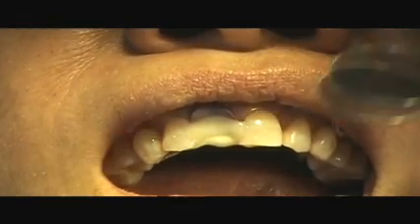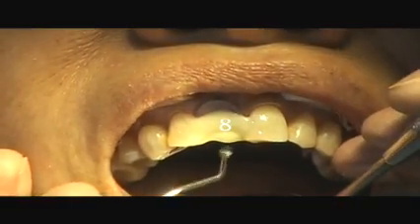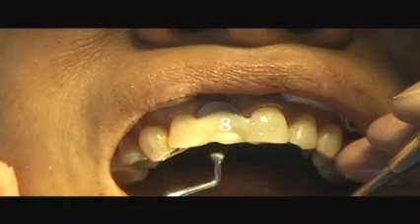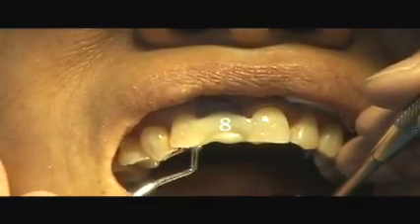A fourth layer is placed on the lingual to ensure proper thickness. Note the mid-portion of the edentulous space and the formation of the lingual aspect of the pontic number 8.